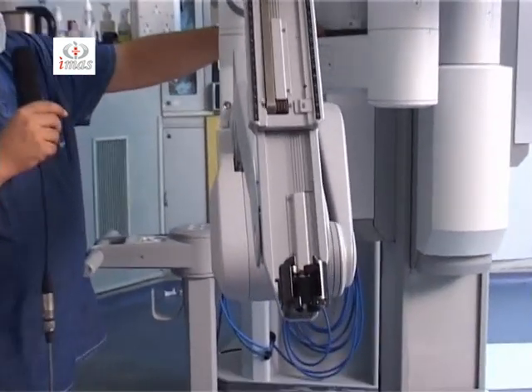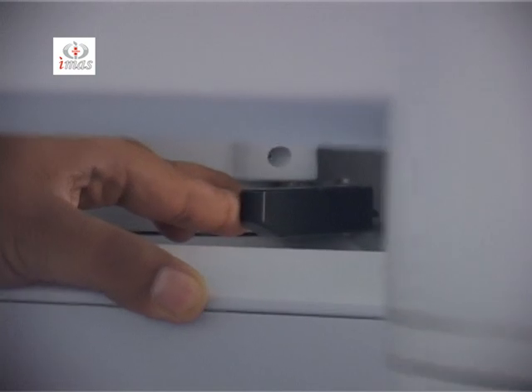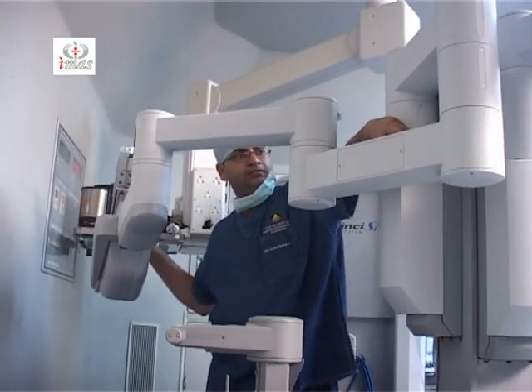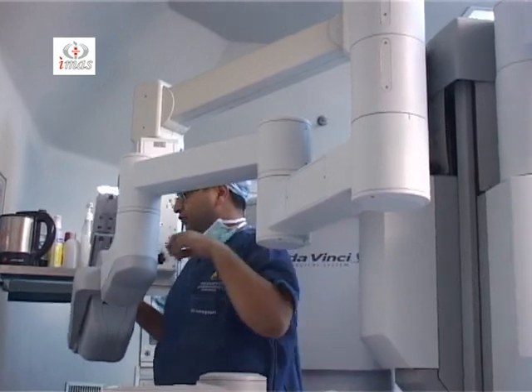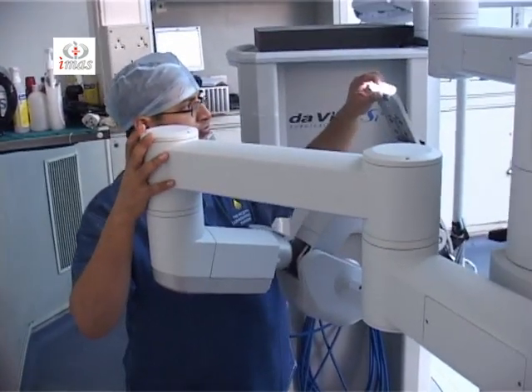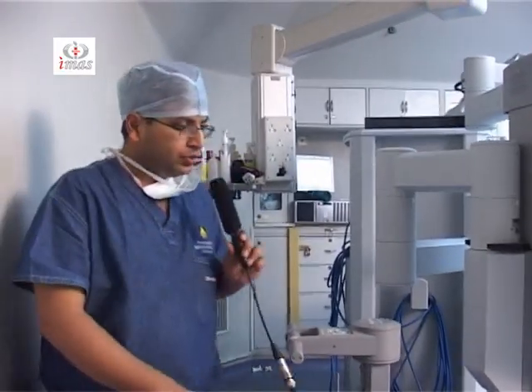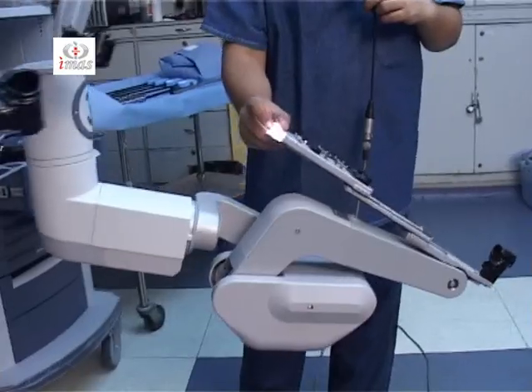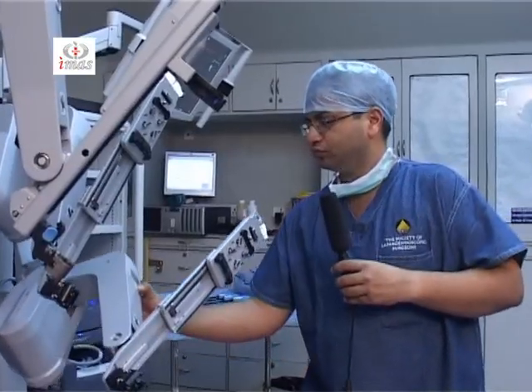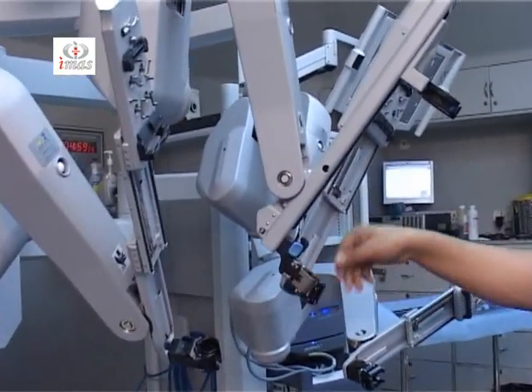There is this lock for rotating the third arm onto the opposite side. So you have to open this clip, press the port lock button and rotate it out of the lock. So now the third arm can be taken to the opposite side and it is locked in position. So this is regarding the movement of the arms.